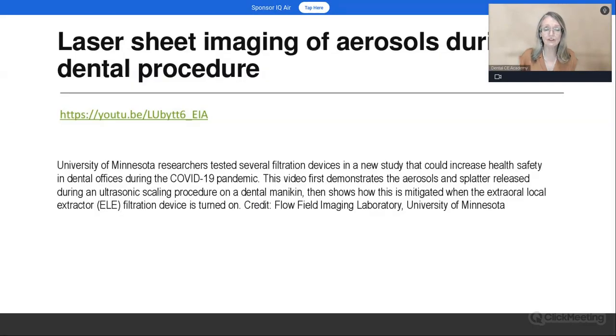I'm going to be showing you a YouTube video here in just a second, but this was the University of Minnesota. These were researchers that tested several filtration devices in a study that they believed could increase health safety in dental practices. And this was during the COVID-19 pandemic. But again, I want to remark that these issues existed prior to COVID-19, and many of these studies existed prior to COVID-19. So I'm going to go ahead and play the video for you.